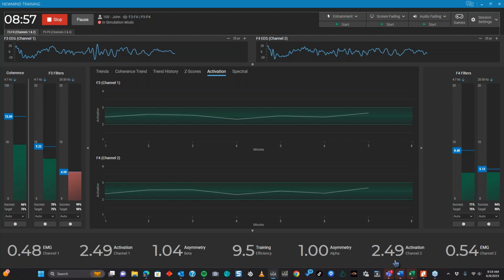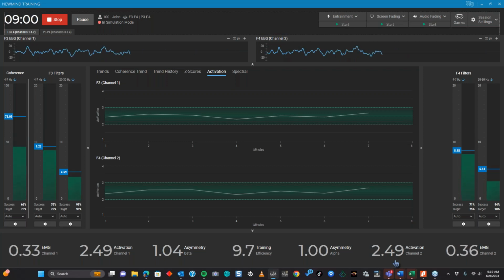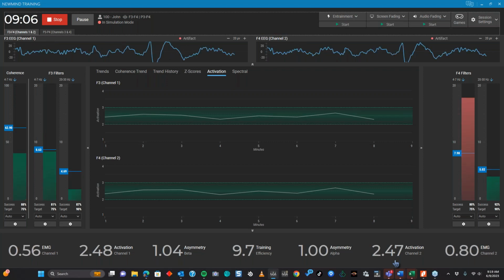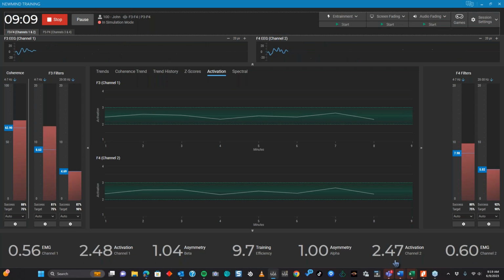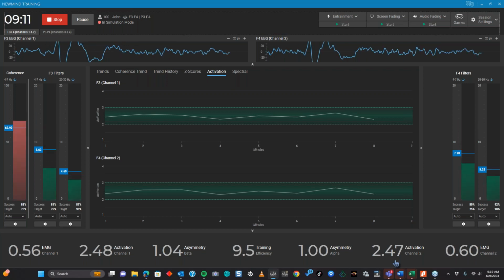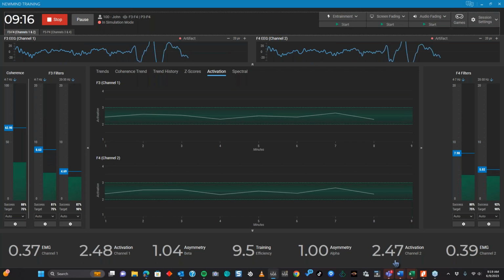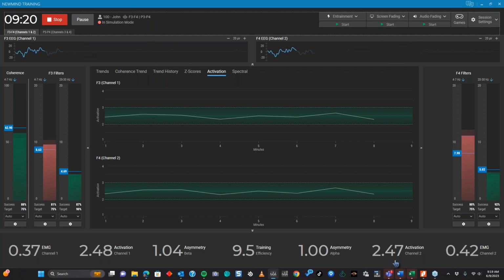And I will just say that now because it comes up on lunch and learns, and it has for the better part of 10 years. On this subject of activation, say we've got somebody with a lot of excessive delta and theta.